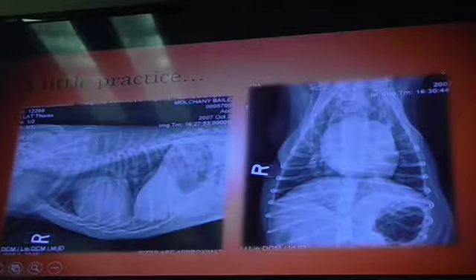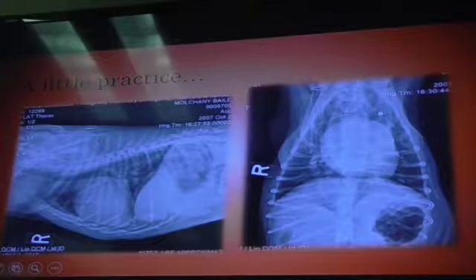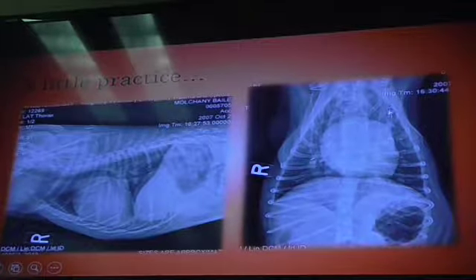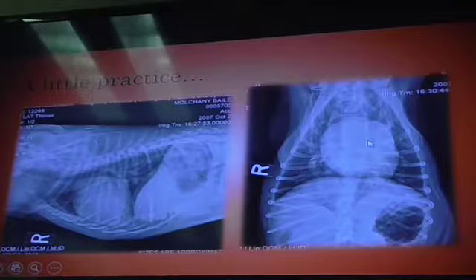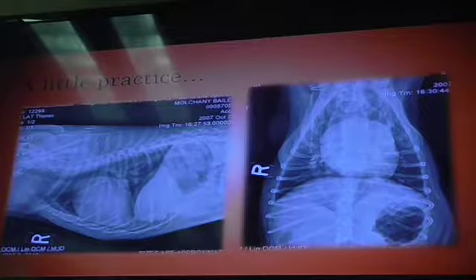Okay? But instead we have some differences, or what we think is differences, in this lucency that makes it seem like there's a lucency here, and then there's another segment here, and then there's another segment here. But that's because we have these bony structures making it seem like it's changing our path. Okay? So the more you see it, you're going to look in these areas and you're going to be able to recognize now, okay? All right.